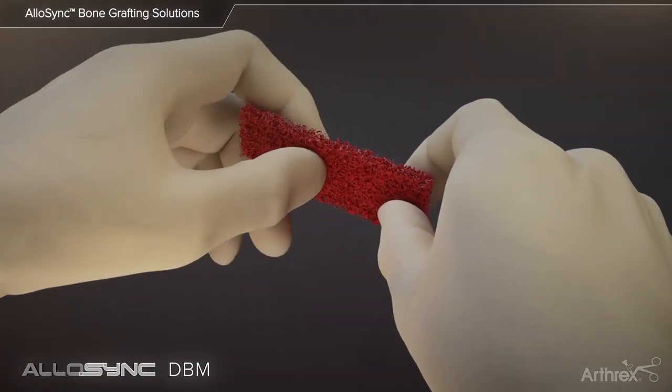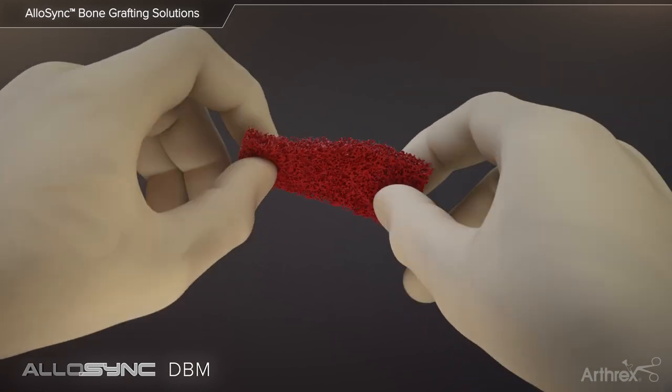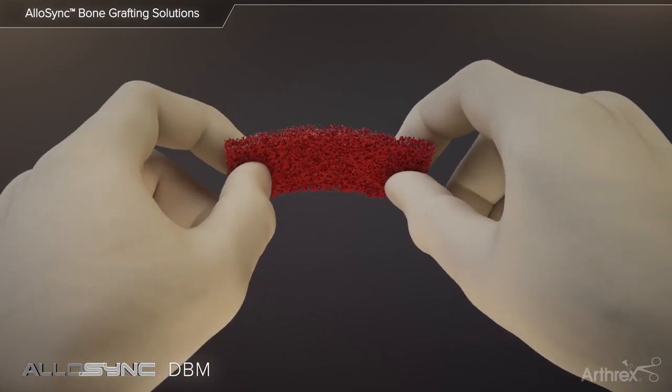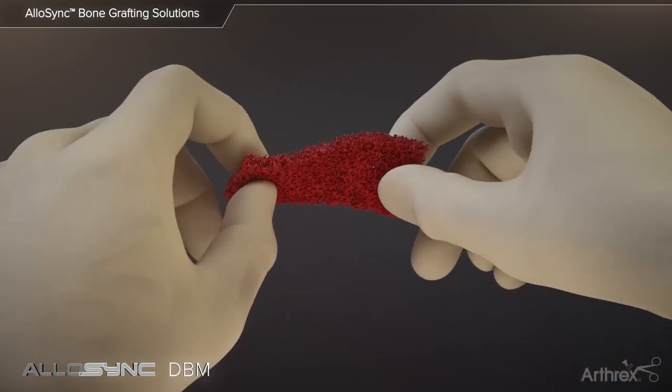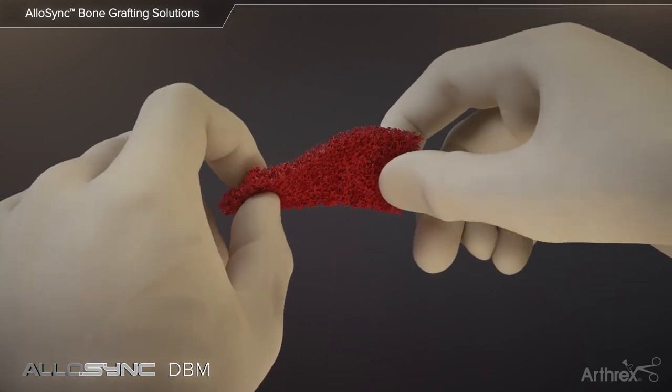Once hydrated, the Allosync sponges and fibers become compressible like a sponge, allowing for flexibility to fit in and around different types of bone defects. Allosync's pliable handling characteristics facilitate minimally invasive surgical procedures with the incorporation of allograft bone.